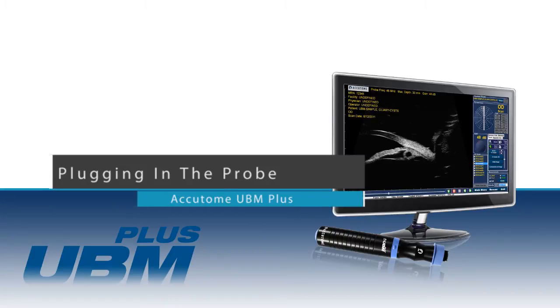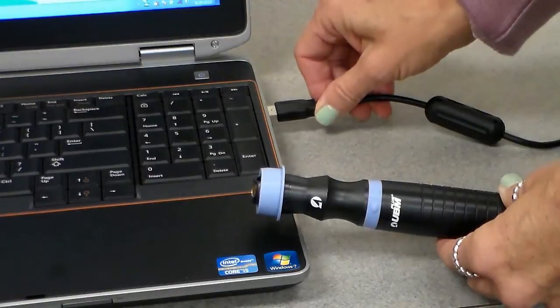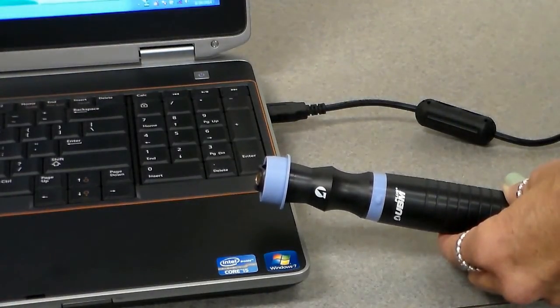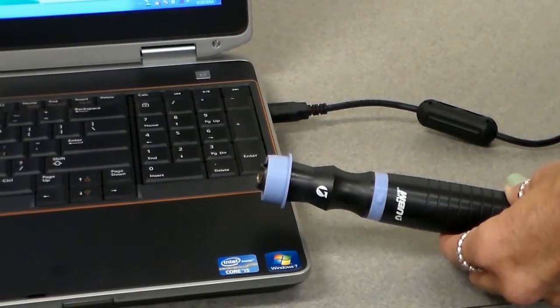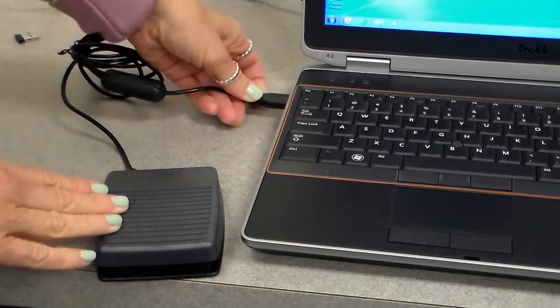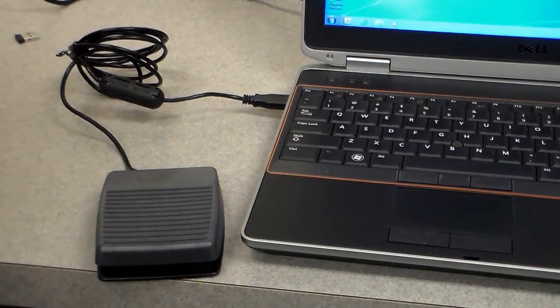Plugging in the probe: once the software is installed, attach the USB cable from the UBM probe to the computer. The UBM probe may take a few moments to install. Your PC should state that this device is ready for use. If desired, the USB foot switch can also be connected to the computer.